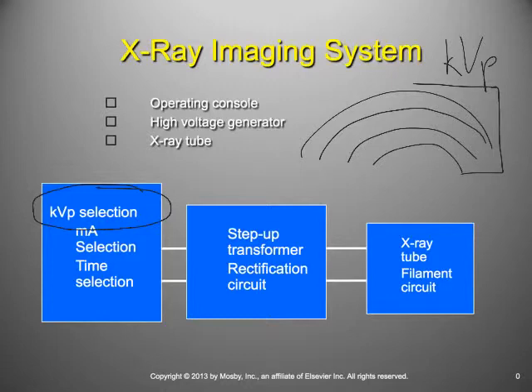So I already talked about shielding. We're going to have shielding between the operator console and the X-ray tube, right? The distance factor, we will talk about some when we talk about the circuitry, but primarily what we're going to be talking about today is time, right? So you can see I have an MA selection and a time selection. And between the two of these things, I'm going to come up with a simple algebraic expression that I'm going to call mAs, milliampere seconds, right?